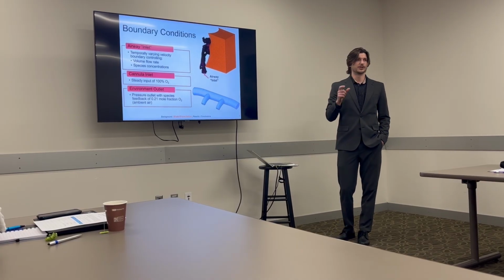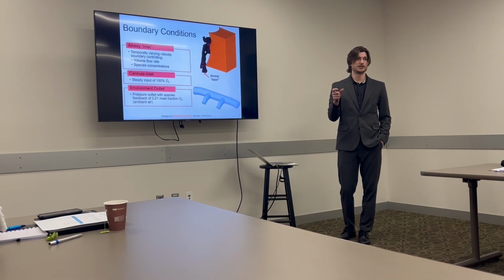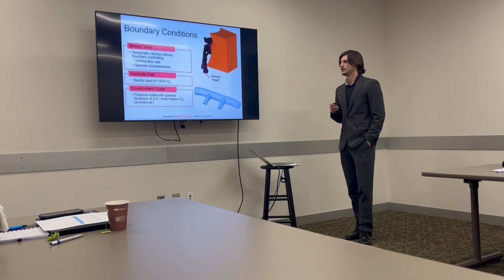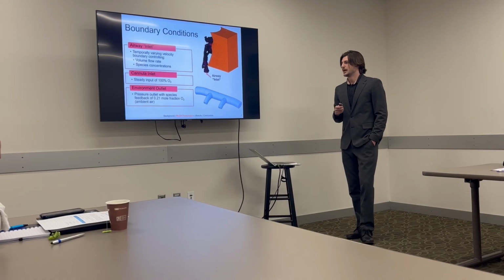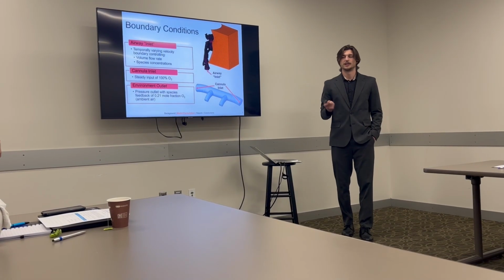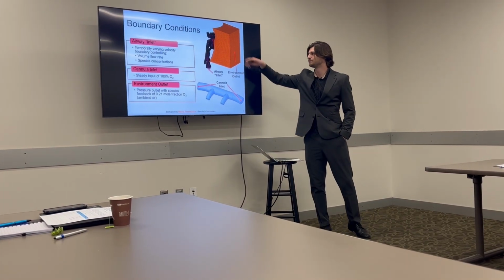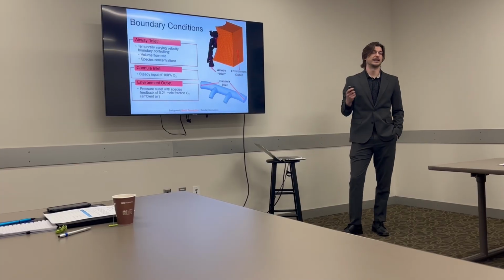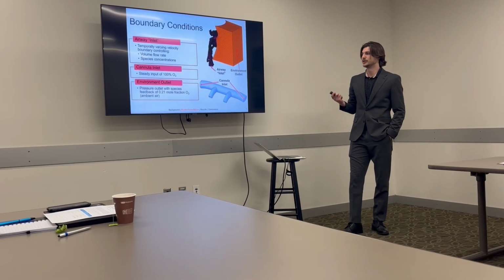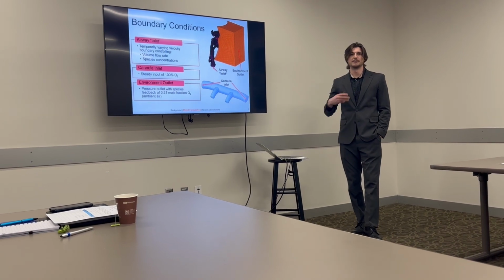There's also a surrogate of cellular respiration in which some of the oxygen is converted to CO2 prior to the start of the expiratory phase. The cannula inlet is a steady input of 100% oxygen, and the environment outlet here, which is covering the patient face now, is a pressure outlet with a species feedback of 0.21 mole fraction oxygen. So basically this is just providing ambient room air.